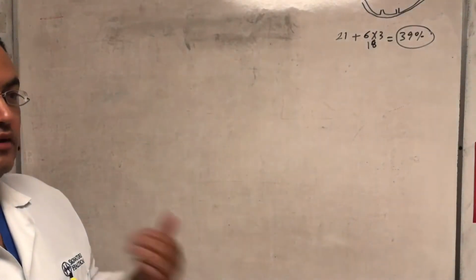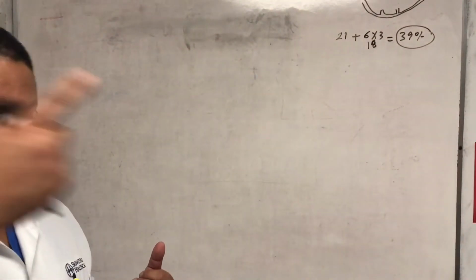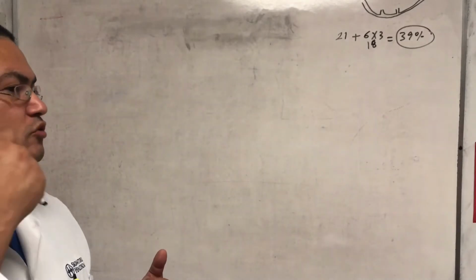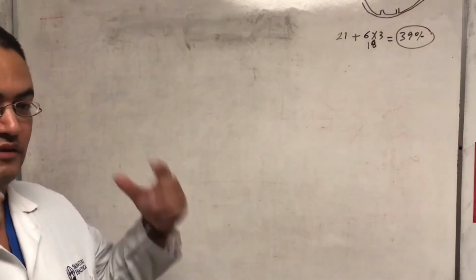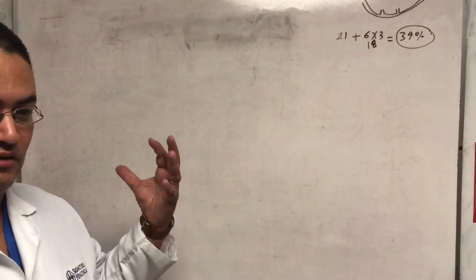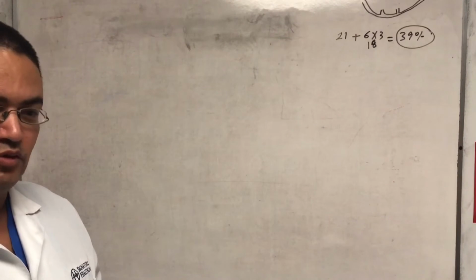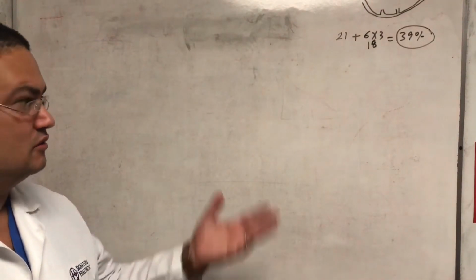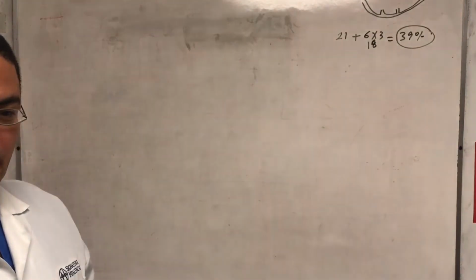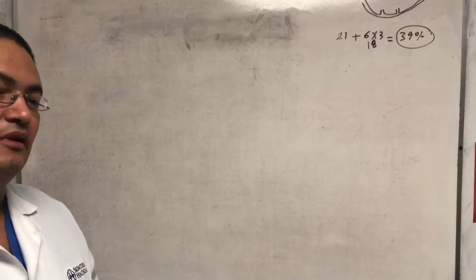So if I want 20 liters per minute, I'll take 6 liters from the nasal cannula, maybe another 2 liters or something that is stored in my nasal crevices and nasopharynx, and then the rest is going to be 21% coming from air. That's why you have 39%, because of entrainment.